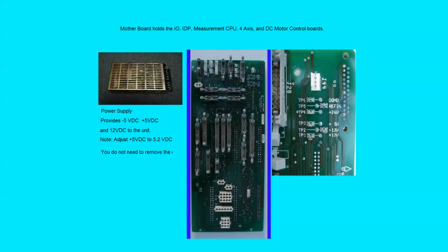The functions of this board are to distribute those power supplies to different parts of the STA Compact. These are also the test points for those voltages. What is important, again, is the +5 volts, +12 volts, -12, and the +26 volts. This is the general place where you make a measurement of those voltages. Again, this will be discussed later in the power supply section.